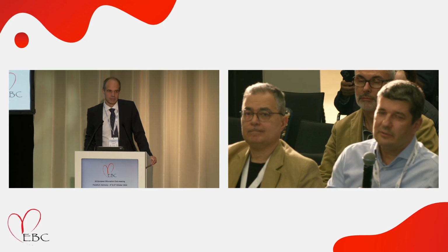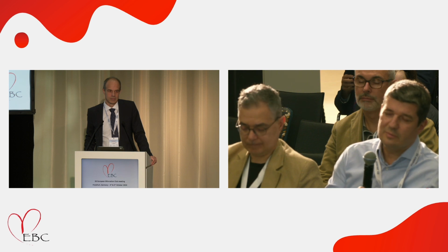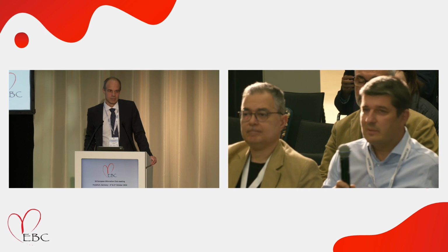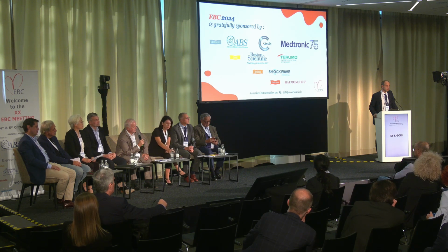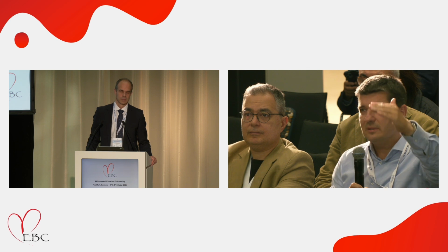And one other thing that maybe should be brought into the light: we should at least also investigate this procedure against DK culotte, because I think if you have OCT, the primary procedure, but I have a feeling that with the TAP, is the side branch ostium fully covered, not on the carina side, but the other side?